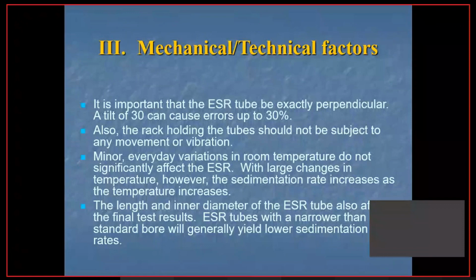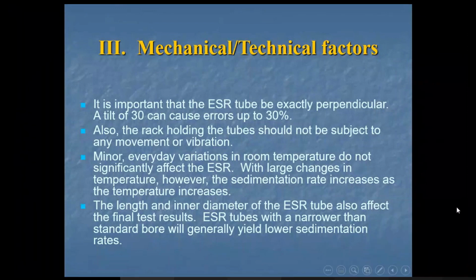So the tube diameter and its height, everything matters. That's what we can see.